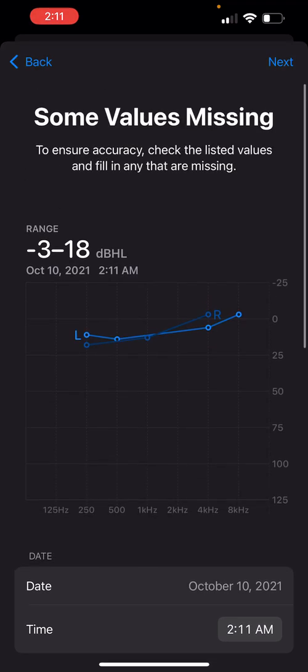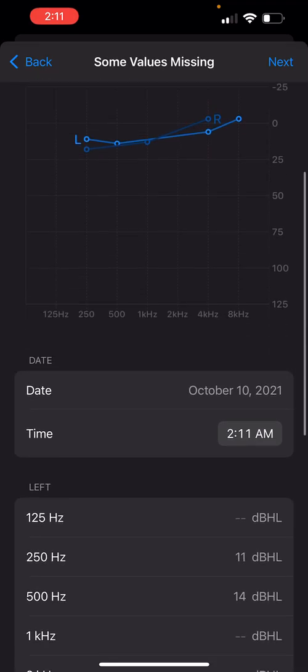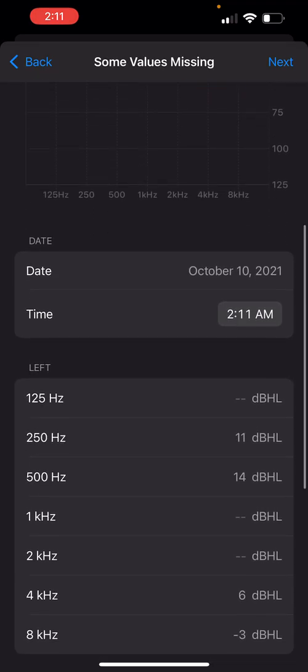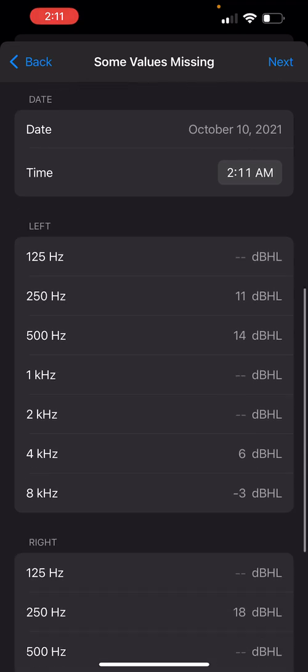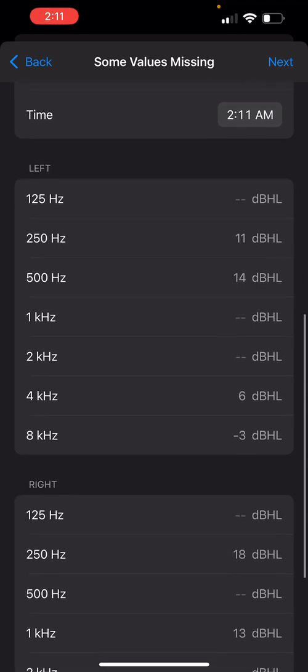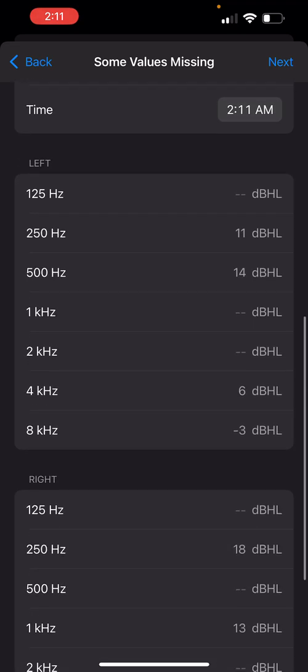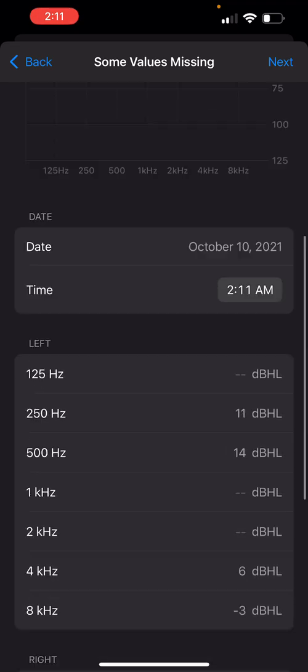Now, it says some values missing. All you have to do is go back and look at the audiogram, and add in the data that's missing, and that's all you have to do.